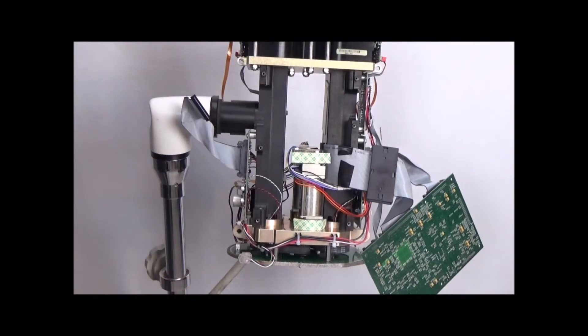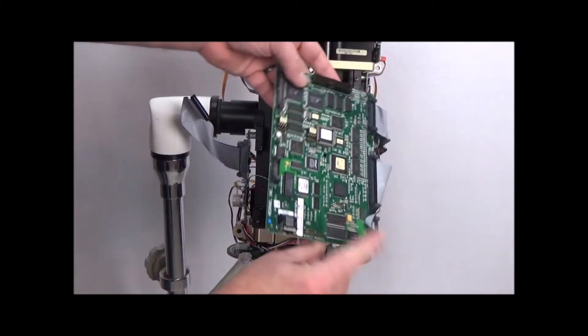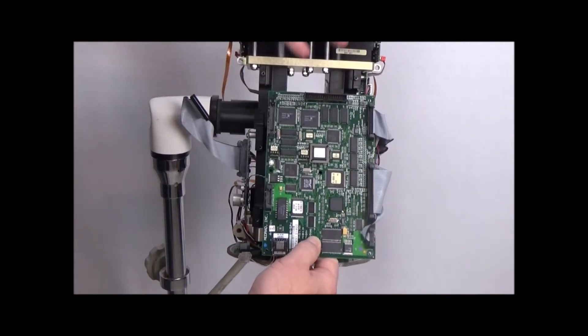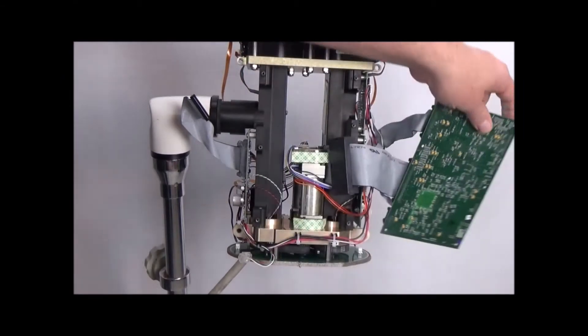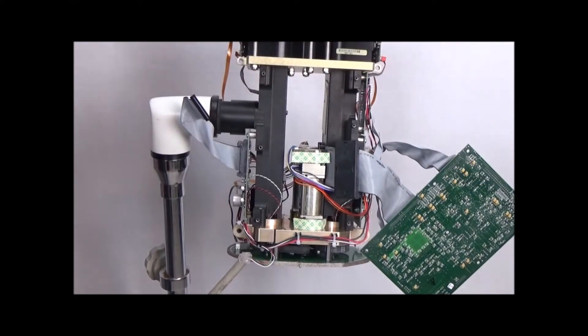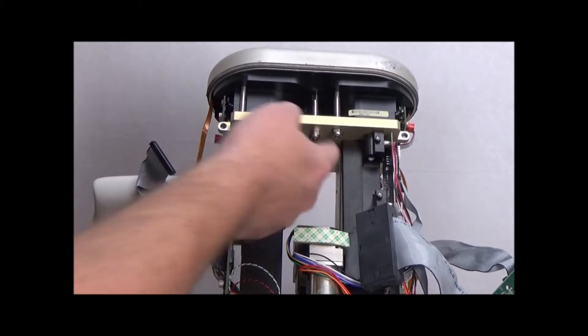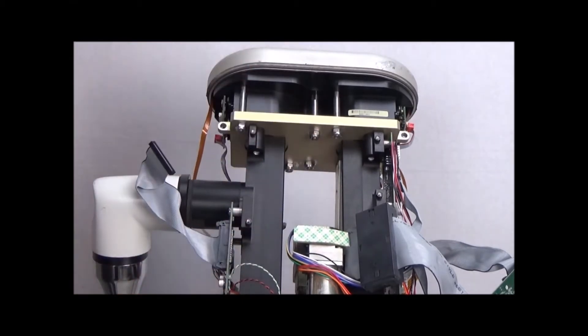Fold that over like that. Now, there was actually a display board connected here that you should have already taken off — but if you've been to training, you know how to do that. This has given us easy access to the six nuts on the underside of this plate so we can easily get this end cap off now.